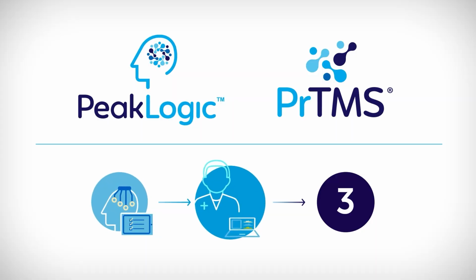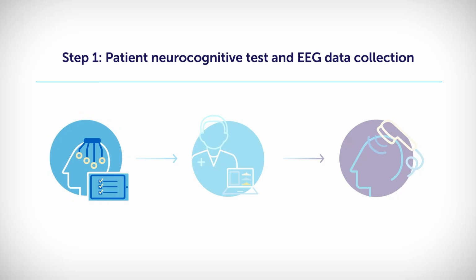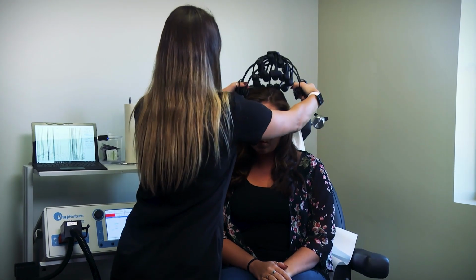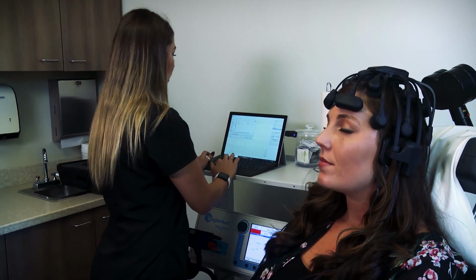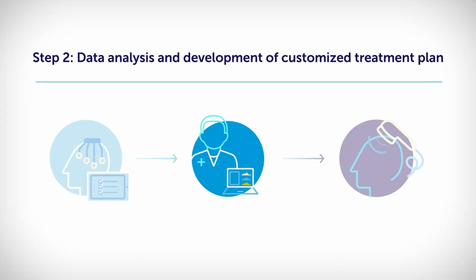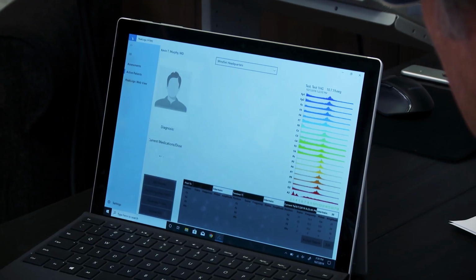I think we take a non-QEEG. We do a spectral EEG evaluation, which is a rendering of the brain after we take an EEG scan. It takes about 5 minutes to do it. We don't plot the data in a time series like you see with quantitative EEG. We plot the data in one single picture, which shows you all 19 brain locations at once based upon frequency and power. Why is that important to TMS?